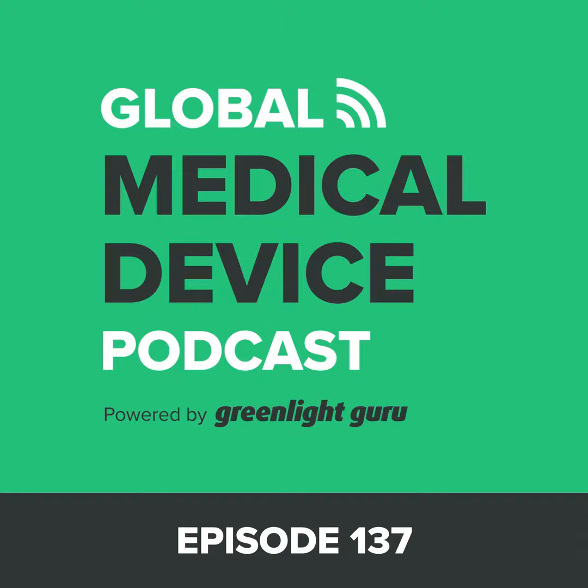Just a couple things that we've already touched on, but I want to reiterate that it is not waterfall, and you can implement it in your life cycle model. It is possible to do that. And for the steps to do that, you would perform a gap analysis and do a mapping to see what you're missing and what you already have in place. And that's the first place to start, with that gap analysis.